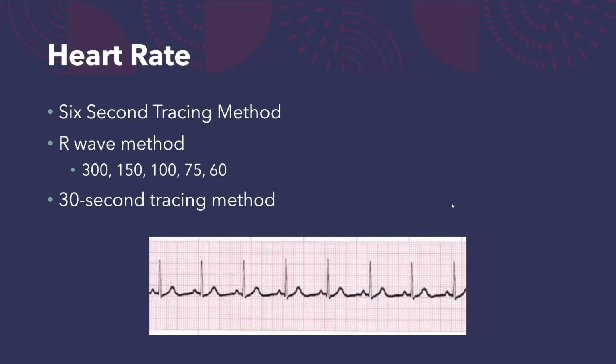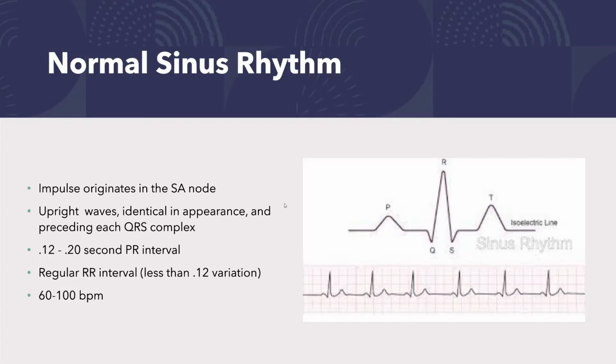be an abnormal rhythm. It's difficult to see, but it looks like there's only maybe 1, 2, 3 little boxes. So that's perfectly normal. And same here, very little gap between the P wave and the QRS complex. That is called the PR interval. If you don't remember any of this stuff, definitely take another look at the cardiac physiology lecture. Hopefully you still know what all these mean, because I didn't plan to review all of that again.